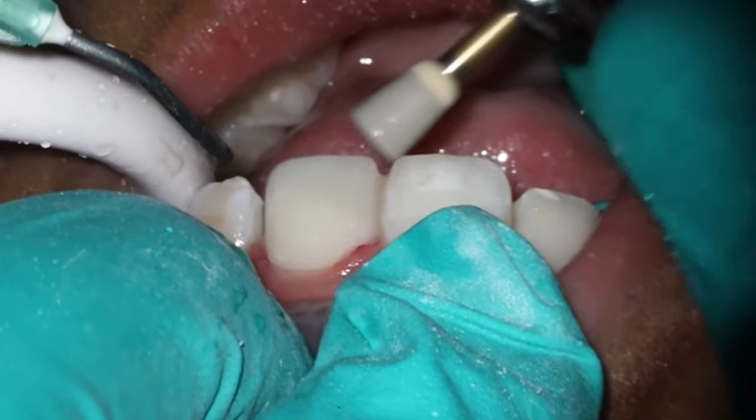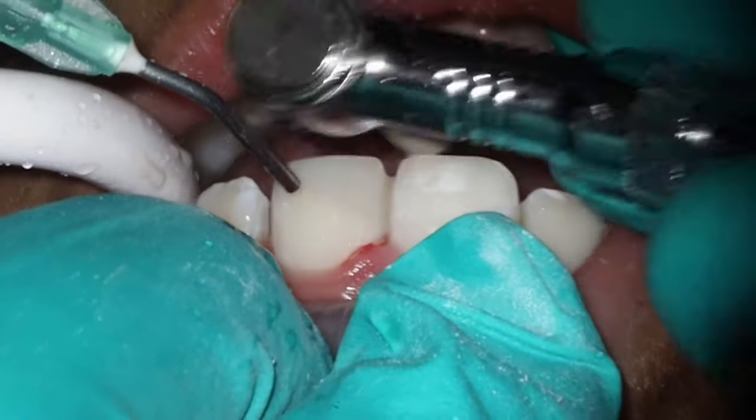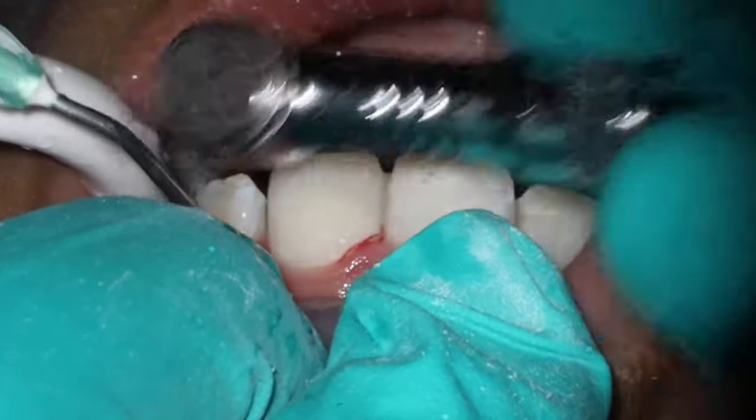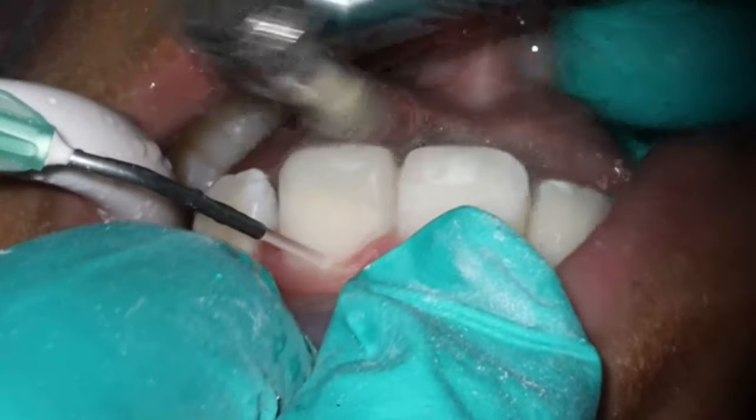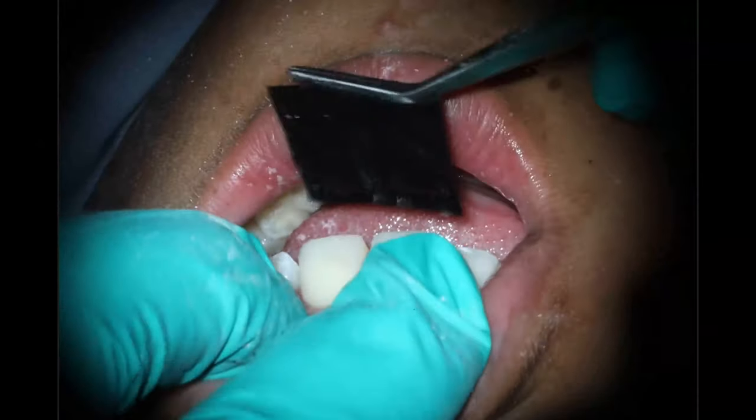Patient actually wanted me to leave it broken. He's a hockey player, and he said it makes him look tough. And I was like, well, you're 11, dude. You need to not do this. So go ahead and check the bite, and then that's pretty much it.